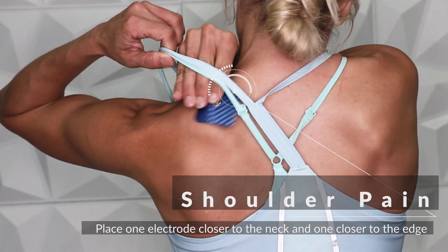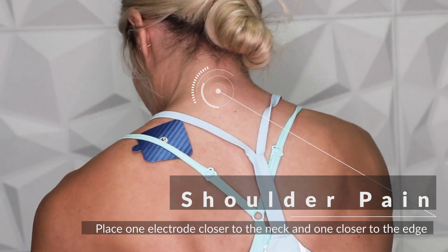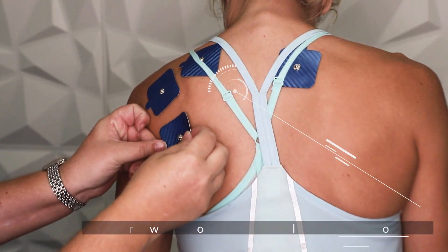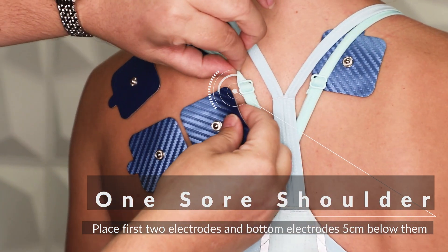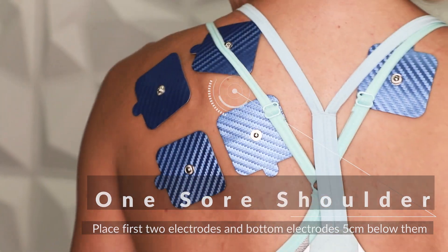For shoulder pain, place two electrodes on your shoulders — one closer to the neck and one close to the edge. If only one shoulder is sore, leave the first two electrodes in place and place the bottom electrodes approximately 5 cm below them.